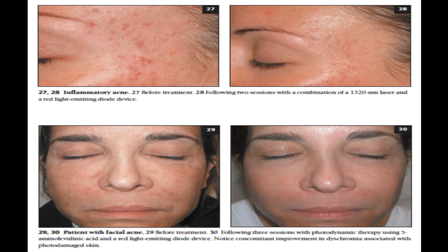Prior to the application of topical photosensitizers, the treatment area is cleansed and preferably degreased using an acetone scrub or microdermabrasion to increase cutaneous penetration. Recently, fractional resurfacing immediately prior to PDT has been successfully used in photorejuvenation and may theoretically also be of use in the treatment of acne.